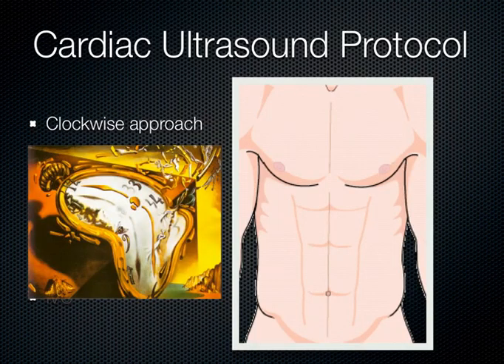So, to conclude, it's sort of a clockwise approach when we're looking at the heart. That's how I think to do it. I start up in the parasternal area. First, I look over to the patient's left hip or left elbow to get the parasternal long axis, and then I aim the indicator over to the patient's right to get the parasternal short axis. Then I slide the transducer just below the left nipple with the indicator to the patient's right, and then I move it to the subxiphoid area with the indicator to the patient's right. So I start to the left, and then I move to the right, and it stays to the right, the indicator that is.